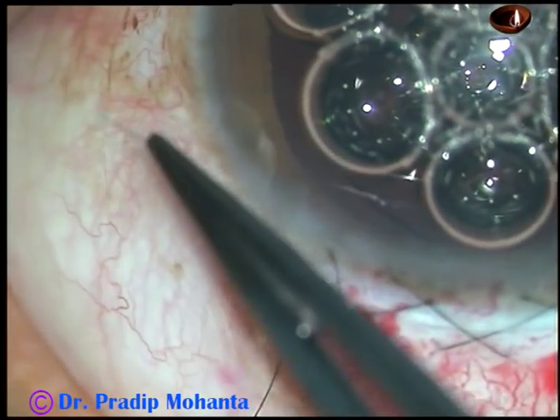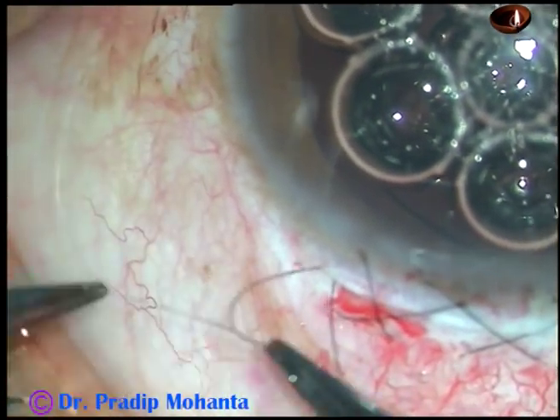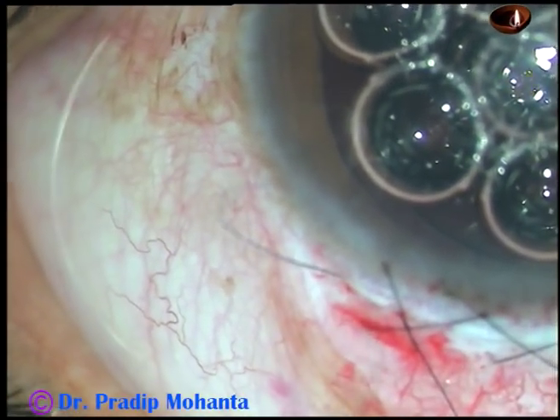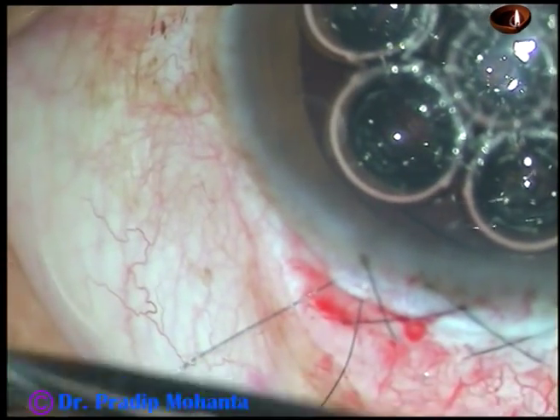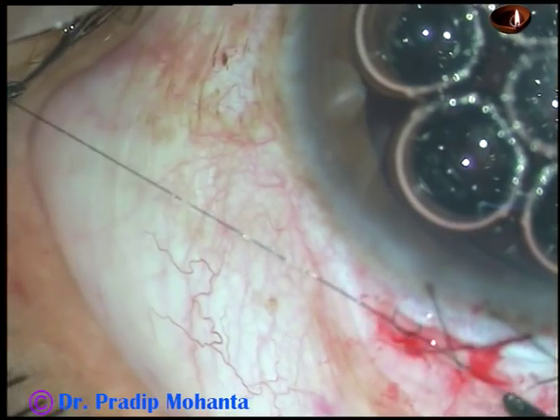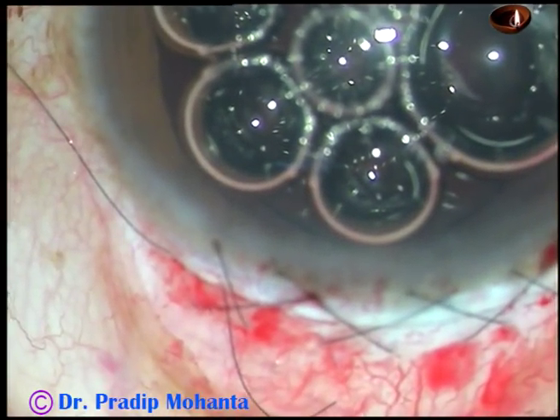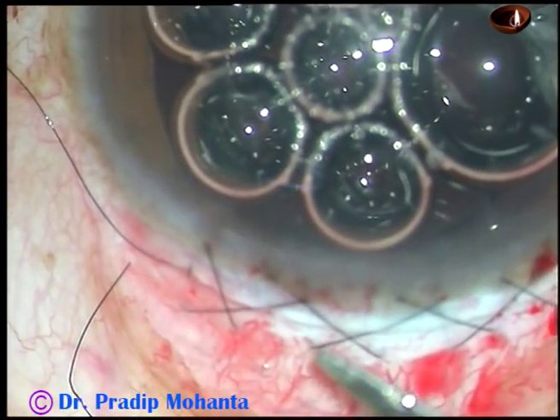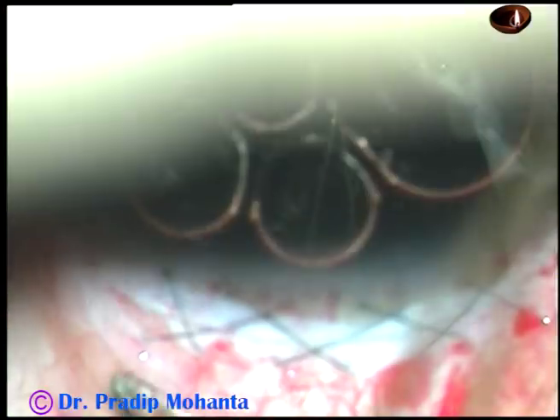Take two throws. This is the final pull — take two throws: one and two. Hold this thread and as you pull, you can see that the knot is going into the tunnel. This is another throw, and this is the final throw. So this is a 2-1-1 suture. Now trim the threads — be careful not to cut the knot. Cut it close to the knot but never include the knot. Just push the knot into the tunnel.